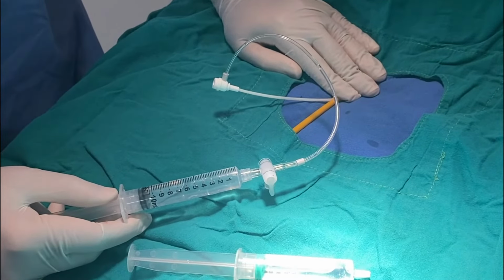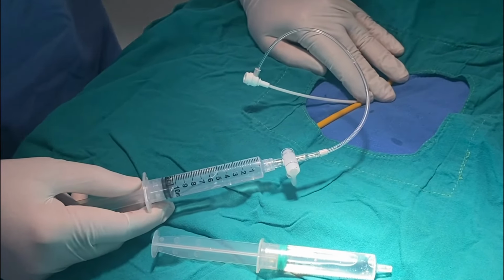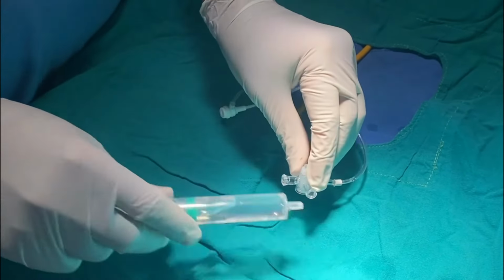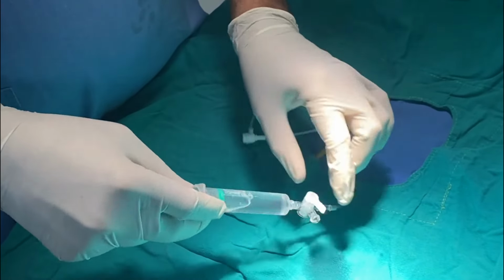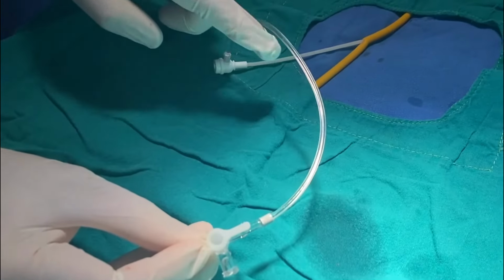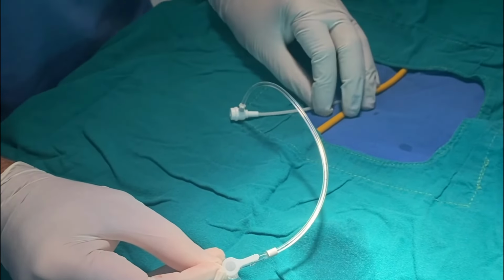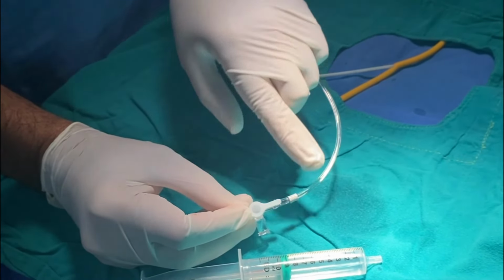So always do the check angio of the femoral after the femoral puncture. Very carefully look in the DSA for any small leak at the puncture site. If there is a leak, press very firmly at that site for 2 to 3 minutes. Do a repeat angio and only then proceed with the next step. Once this is over, you can flush this with normal saline. Once the contrast is over, take this again, flush it, aspirate always, and then flush it properly. Close it and keep it. Always be very careful that this complete tubing from here till here is full of saline only, not blood. If there is any blood lying here, it will clot inside and occlude the femoral artery. So always, during the whole procedure, fill this whole area with saline and see that there is absolutely no blood in this area.